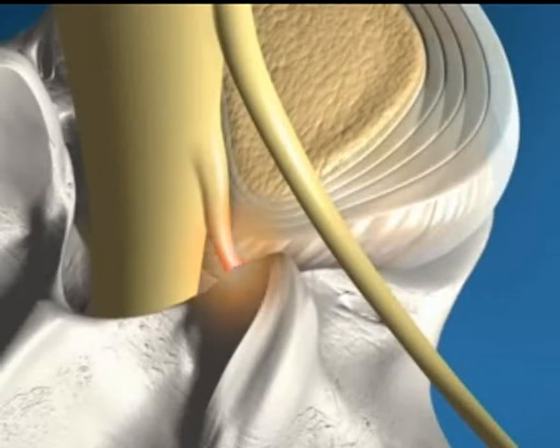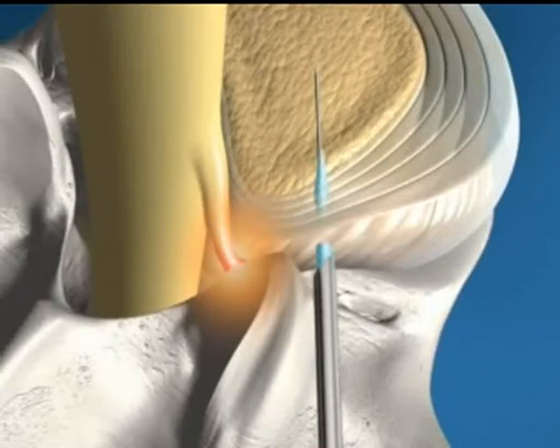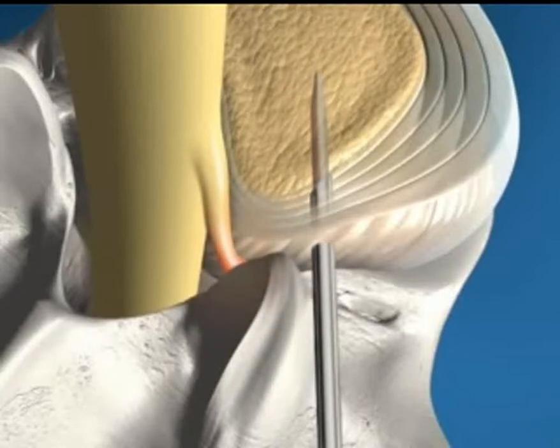Fluoroscopy is used to accurately place a guide wire through Kambin's triangle and into the center of the disc. A dilator is inserted into the cannula and the construct is carefully placed over the guide wire into the annulus. The dilator and guide wire are removed after verifying correct placement.